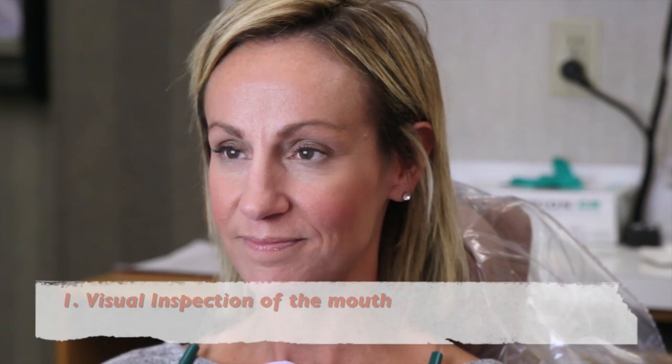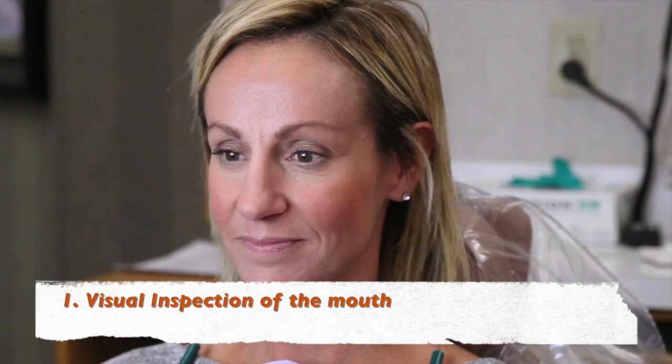Okay, so here we are ready to take our impression. The first thing we're going to do is a visual inspection of the mouth, and I'm going to do that with my loops on. We're looking first of all to see, is there debris? Has the patient just recently cleaned their teeth? Do we have a lot of debris in there? Does she need to go brush her teeth?